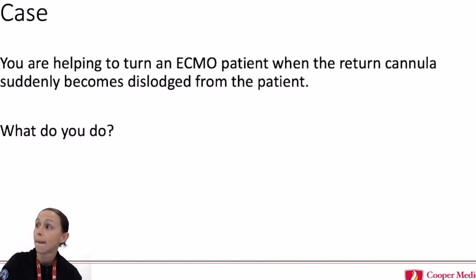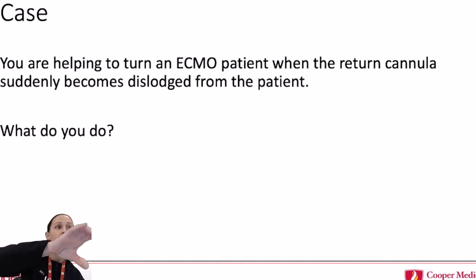And I think just to be clear, if you have the event where this is happening and they have a suction event where flow stops, turn down your flow. That might release it and then you can just gradually come up. That's the emergency situation. And then if you need to get volume, like we talk about albumin, there's no magic to albumin. It can be LR, it can be normal saline, it doesn't have to be albumin. So if you have other fluids in the room, it's fine. When you have your perfusionist at the bedside, a lot of times it's faster for them just to run whatever crystalloid they have attached to the ECMO circuit through the circuit to help pop things up.